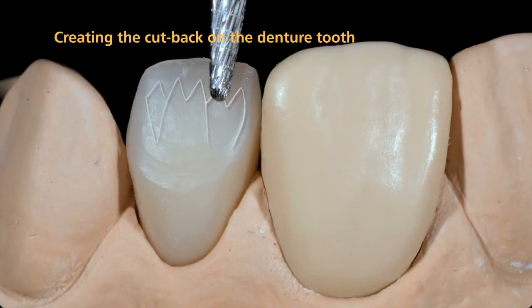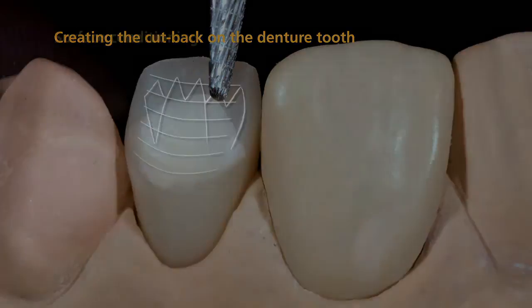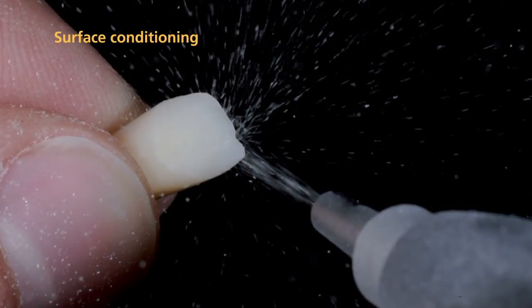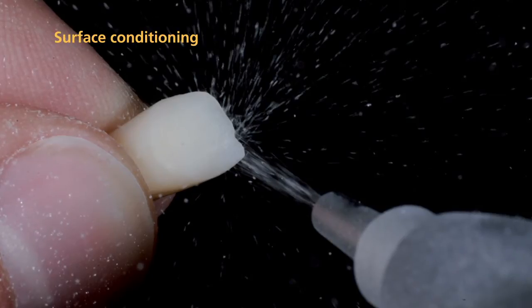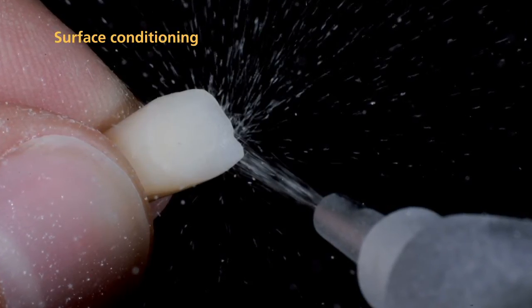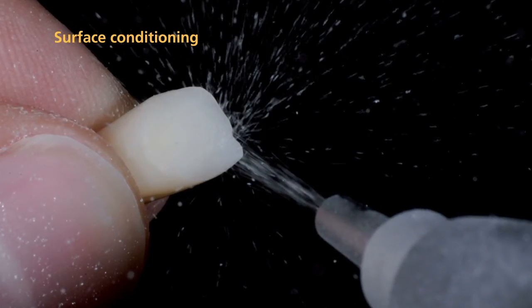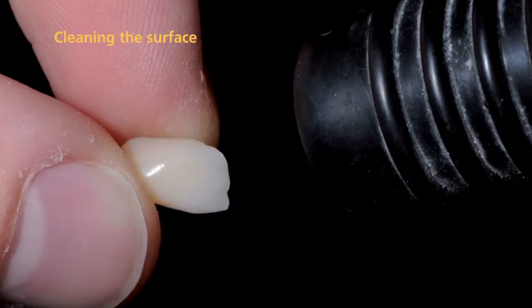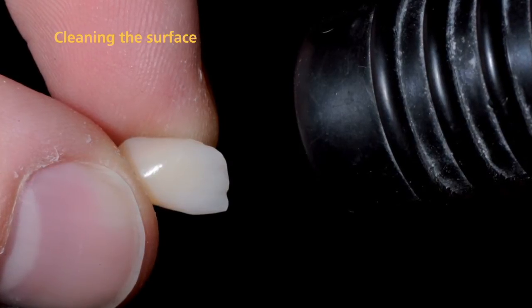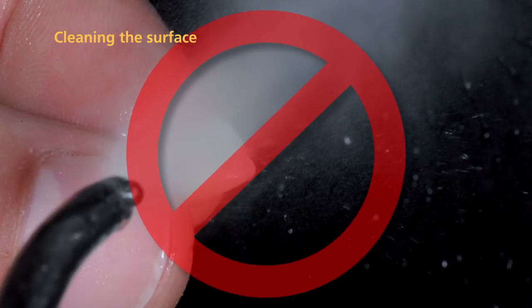First, create an individualized cutback on the dentured tooth by grinding. Carefully blast the surface to be characterized with aluminum oxide of a grit size of 80 to 100 microns using a pressure of 2 to 3 bar. Next, remove residue with oil-free air. Do not clean the dentured tooth surface with steam.